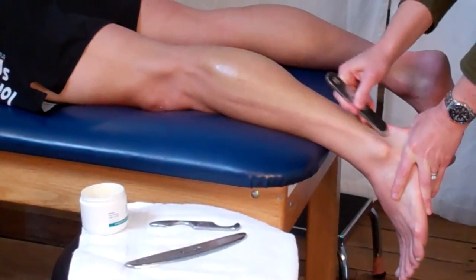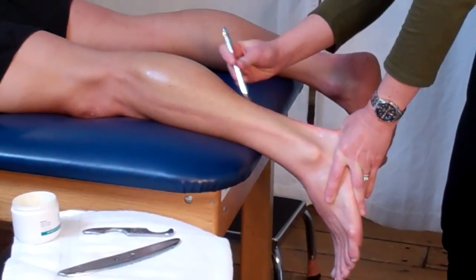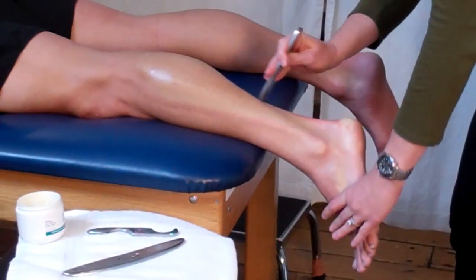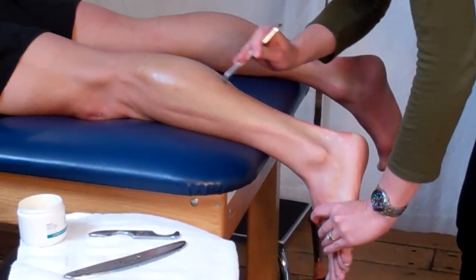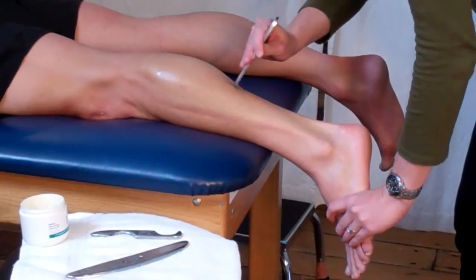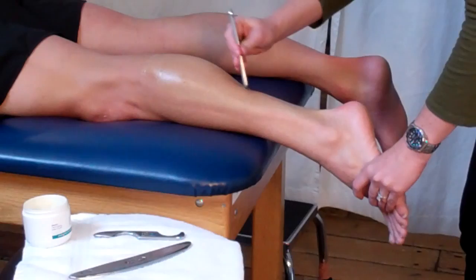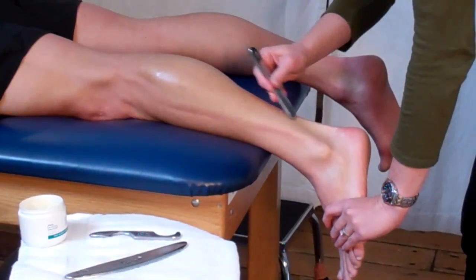The tools help to facilitate the breakup of soft tissue adhesions and help to loosen tight structures that are contributing to the injury. It decreases muscle spasm and helps remodel scar tissue, thus helping decrease pain and increase range of motion. The Graston Technique helps to achieve these benefits quicker than the use of other soft tissue techniques.